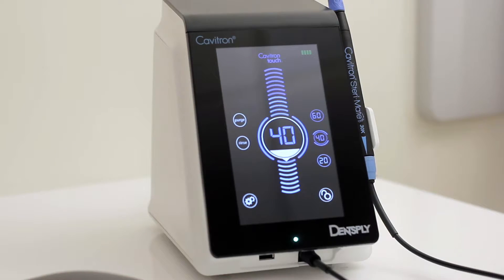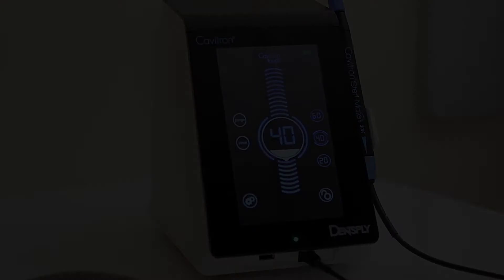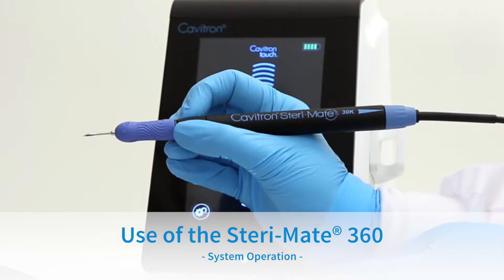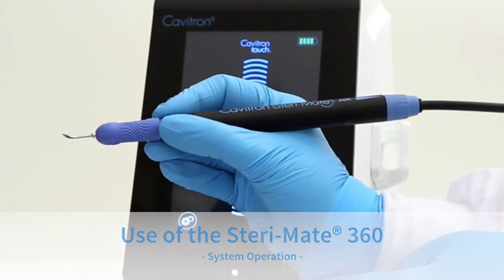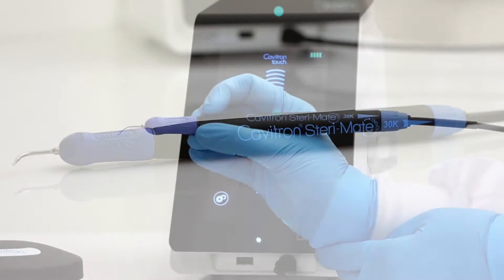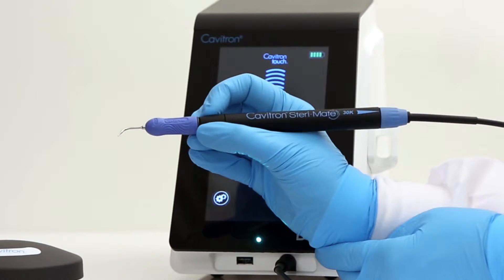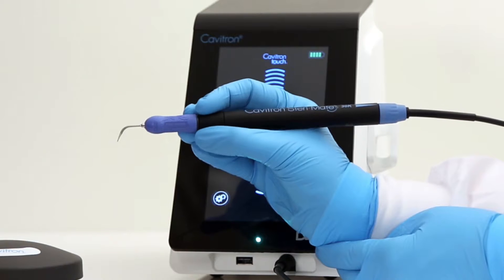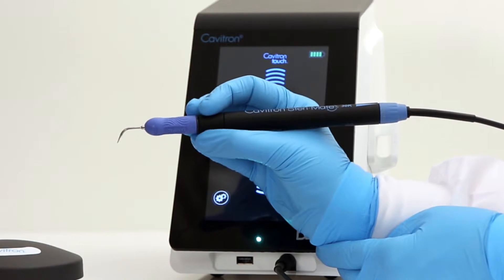All of these features are detailed in the directions for use and additional videos. The exclusive SteriMate 360 swivel handpiece allows the clinician to fully rotate and insert, and also allows adjustable hand positioning with free-flowing movement, providing ergonomic benefits.